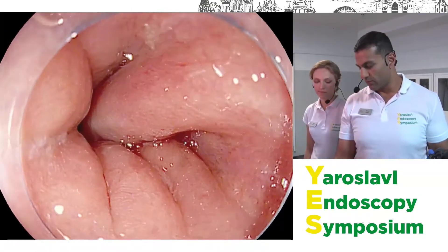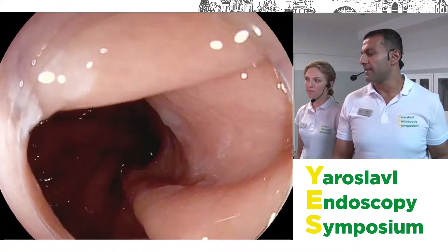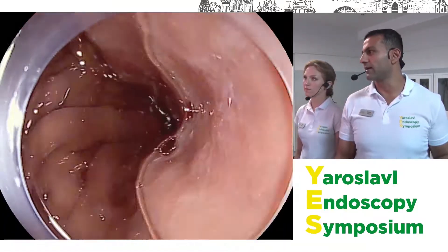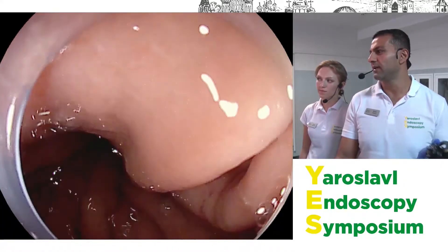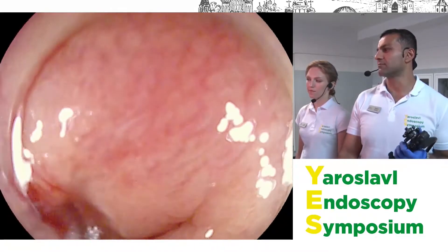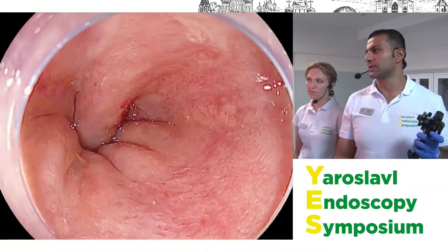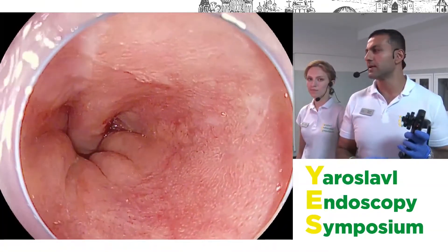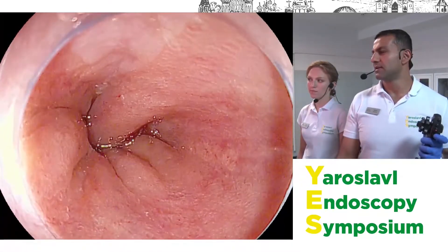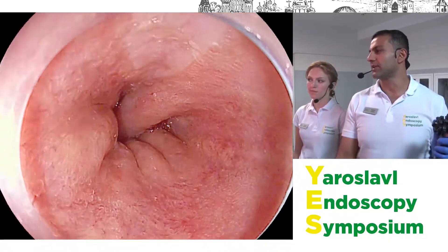We can see the top of the gastric folds are at about 40 centimeters from the incisors. The next thing is the diaphragmatic pinch — he probably has about a two-centimeter hiatal hernia, which is likely why he has Barrett's. The most important thing for consistency of reporting — so you can tell if there's been regression after therapy — is the C and M classification, the Prague classification.